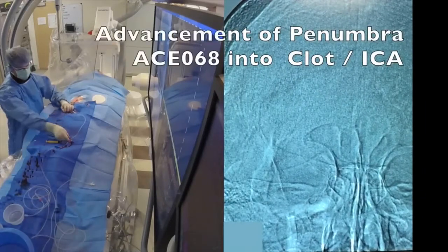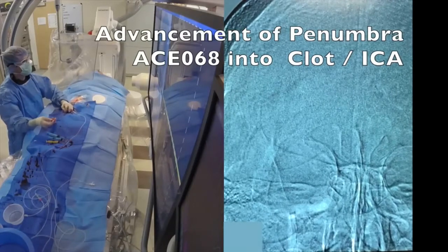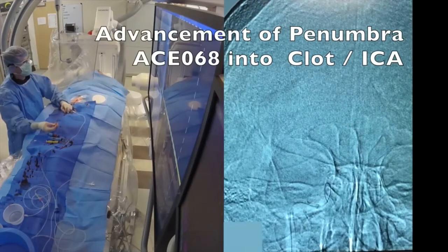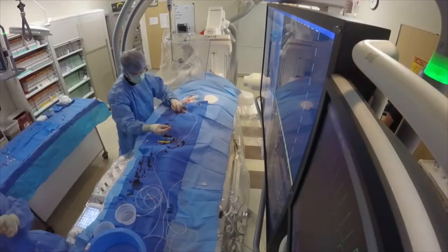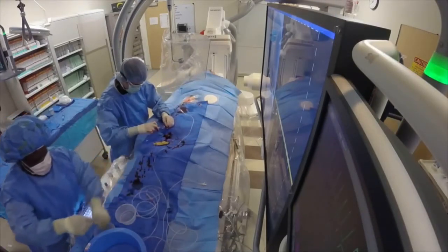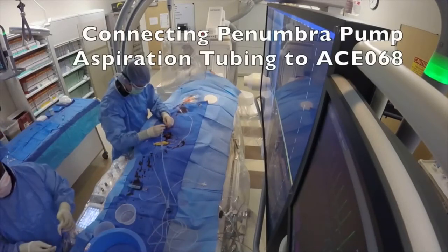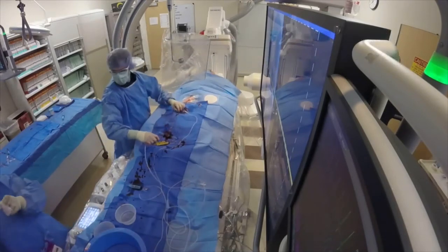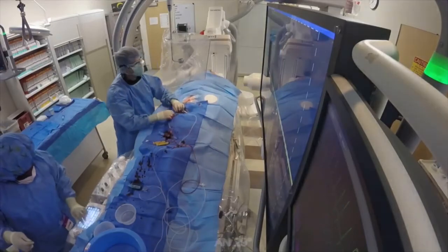You can see the guide catheter, and the ACE-68 catheter is coming up — it is now out of the guide and into the internal carotid artery on the right side. We're removing the wire that we advanced the ACE-68 over, and now we're hooking that catheter up to a vacuum or suction device, which is going to help us remove the clot blocking the right internal carotid artery.